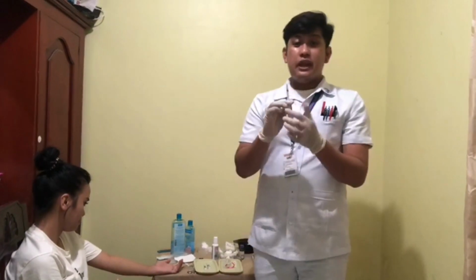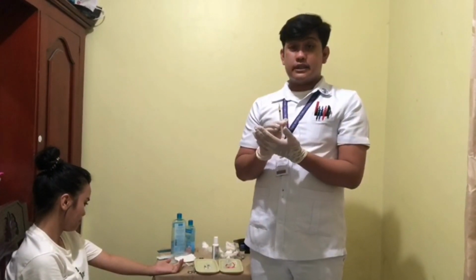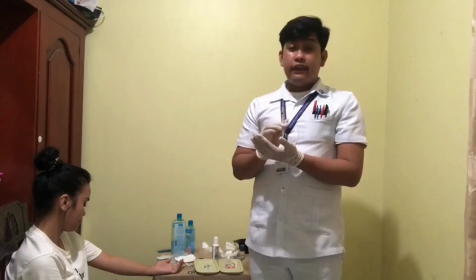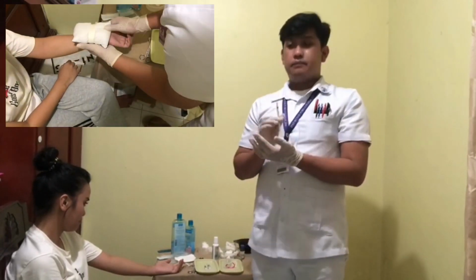Okay, so now I will inject the fluid. We'll first have to stretch the skin at the injection site, pulling gently with the thumb and forefinger of our non-dominant hand. Then insert the needle slowly at a 5 to 15 degree angle through the epidermis, then the dermis.